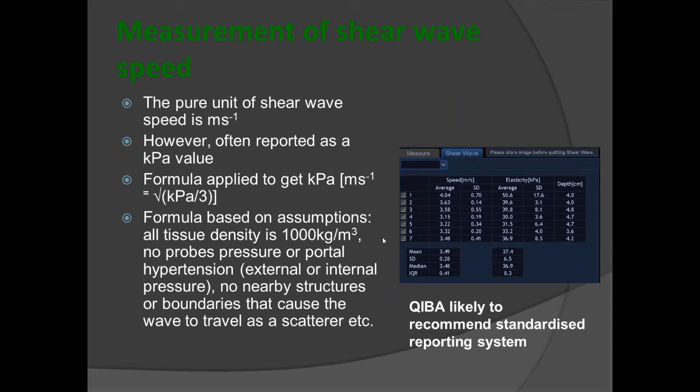And then this is probably one of the most important factors, is that we can measure in either meters per second, which is a true shear wave value, or an elasticity coefficient, which is kPa. Now, we get asked quite regularly, do we report in meters per second or kPa? Well, we're fortunate that with most manufacturers, you can get both sets of data. But at the moment, people are looking at whether we should be using kPa at all.